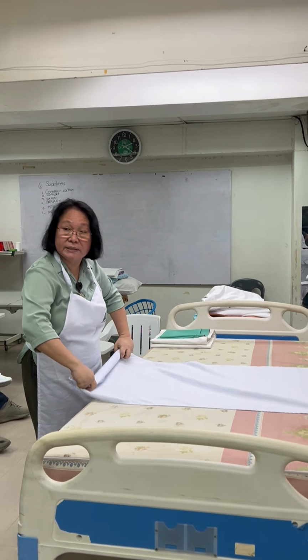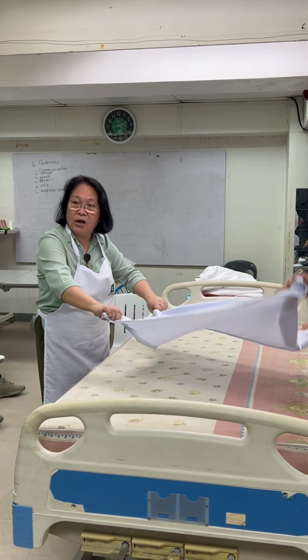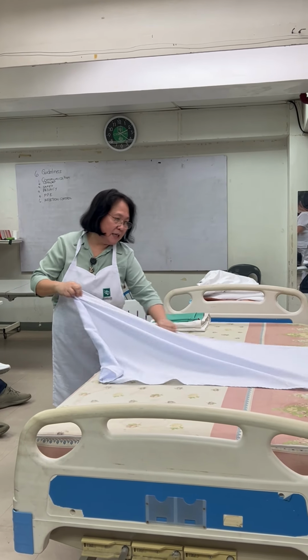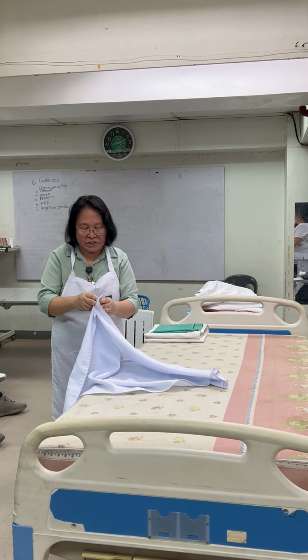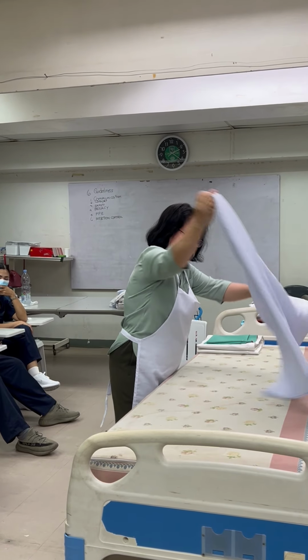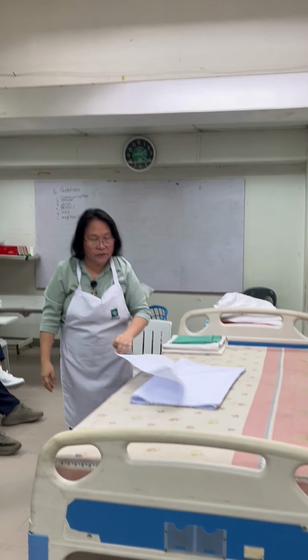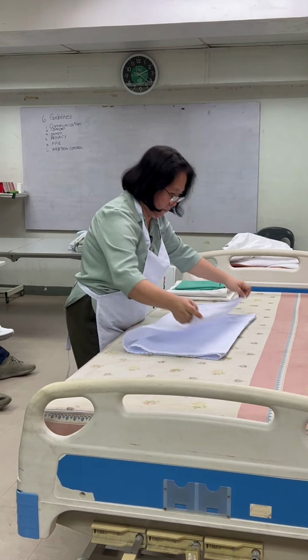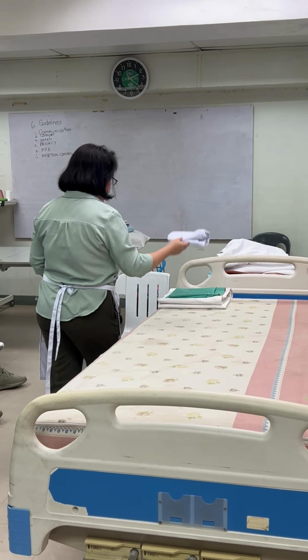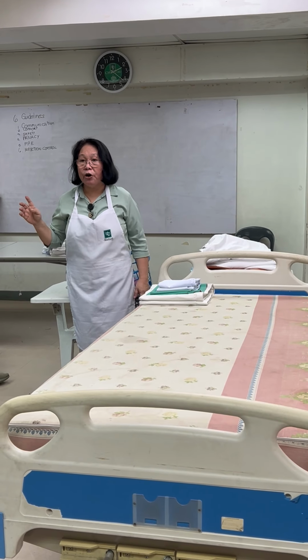You roll it, di ba you have it sa inyong BLS? Yeah. And then 1, 2, 3 up or 1, 2, 3 down. Okay? So, this is the draw sheet or lift sheet. Okay? So, again, this will touch the patient and then, so, good to good gihapon siya. Okay? So, the same, center fold, ari gihapon ang opening kay ato ang i-drop. Okay? Good side ang mo touch ni patient. Okay? We already have your bottom sheet, rubber sheet, draw sheet, and then your top sheet or your blanket.